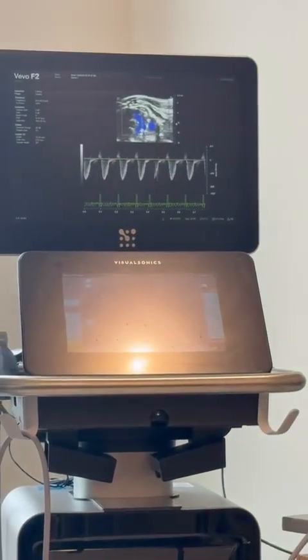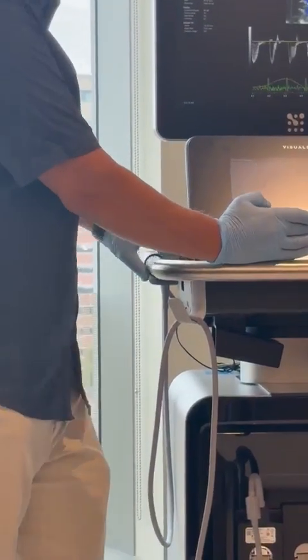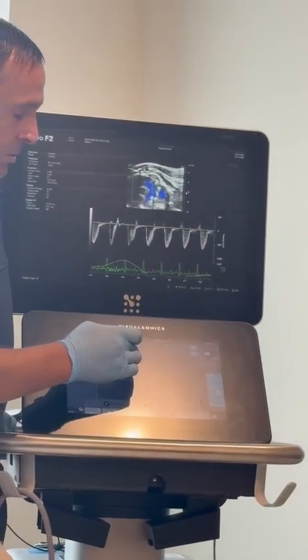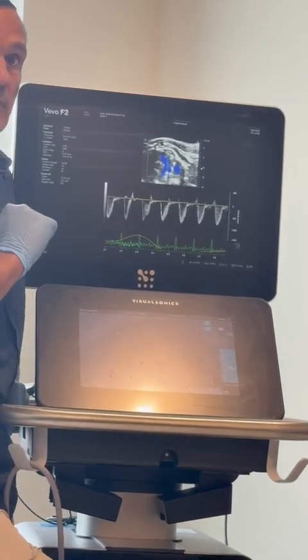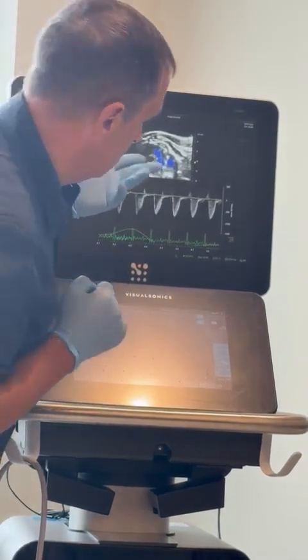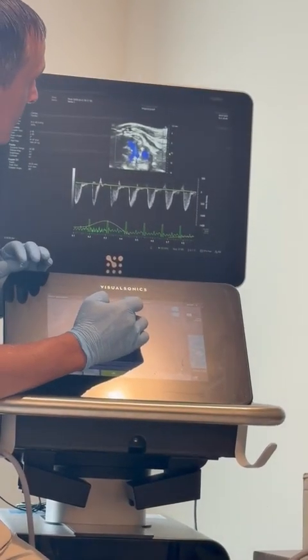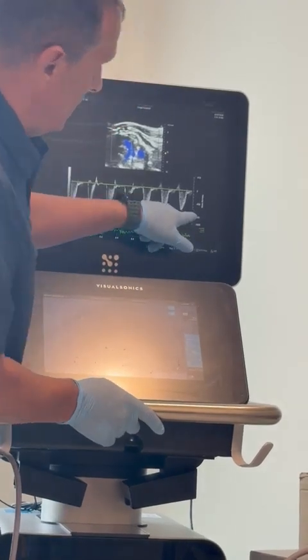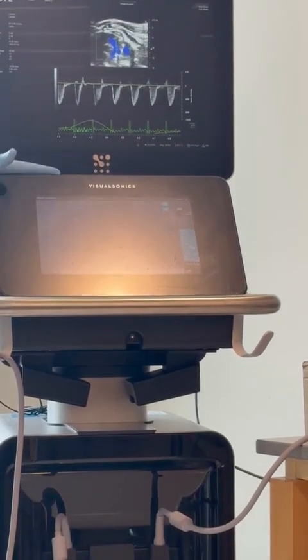Okay. Any Doppler scan is very angle dependent. So I'm just going to freeze this, and right now my angle is at 20 degrees. Now if I move this angle to 50 degrees, the only thing that changes is my scale, right? So right now I'm at 48 degrees, and my velocity is somewhere around 800. If I bring this back to where it should be, which is around 20 degrees, my velocity is now about 600. So be really careful when you're setting your angle.